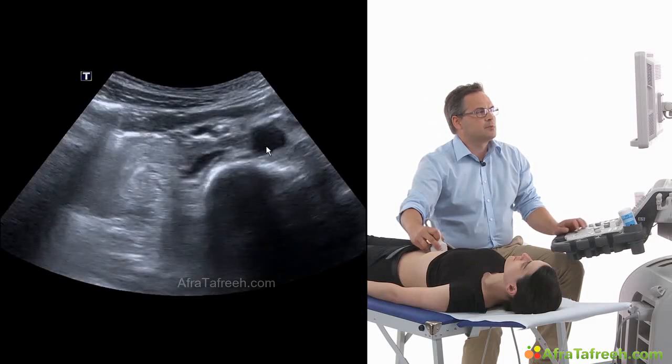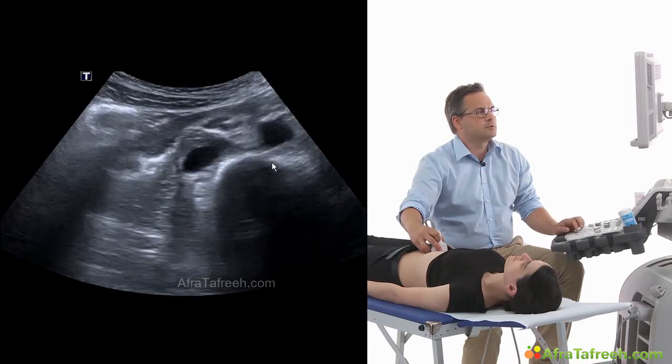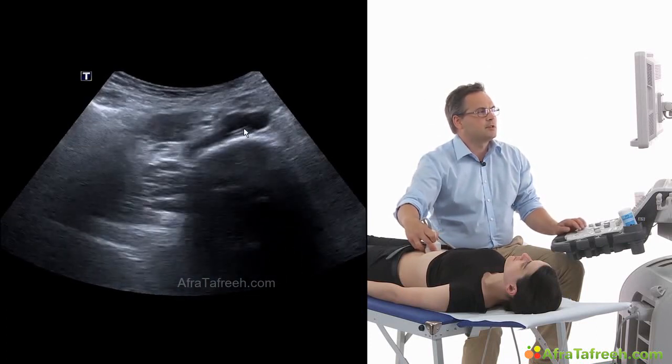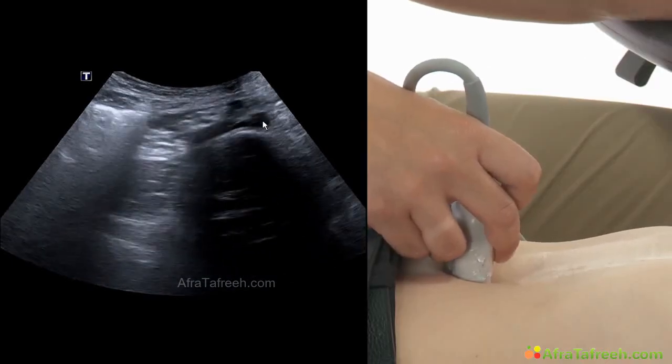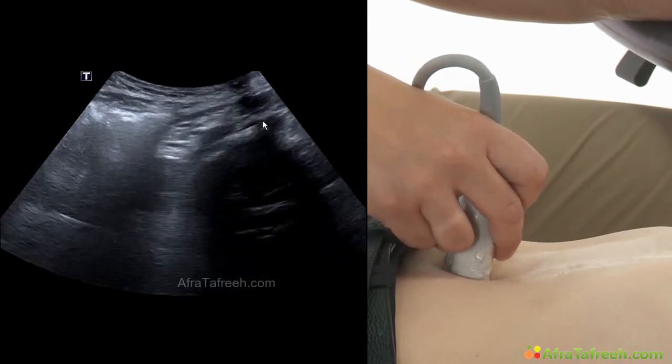Over here we can see the bifurcation at the level of the 4th lumbar vertebra, and we can easily detect the right and the left common iliac artery over here.